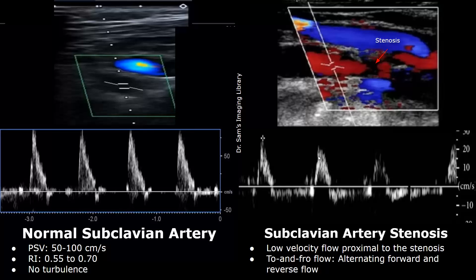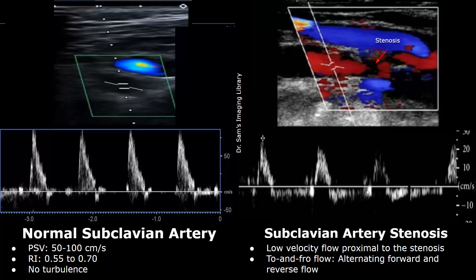At this point, the velocity is between 20 and 30 centimeters per second, which is lower than the normal range. There is also to and fro flow — that is alternating forward and reverse flow. The flow above the baseline is the forward flow, and the flow below the baseline is the reversed flow.